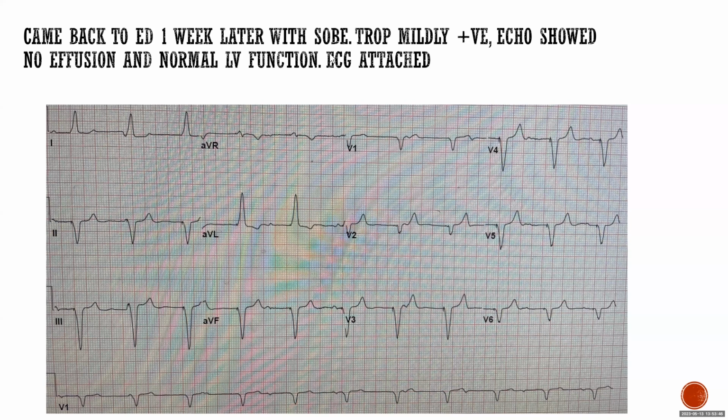Can we tell it is VVI? Well, VVI is programming. That's a good point. So maybe someone changed the programming to VVI. This would be the ECG. You're right. But assuming you didn't change the programming, this patient just came to the emergency room. No one changed programming, and now the ECG looks like that. That's why we suspected atrial lead malfunction. But if you decided to change it to VVI for whatever reason, then that would be a normal function because you ignored the atrial. Yeah. Good. Any questions so far?